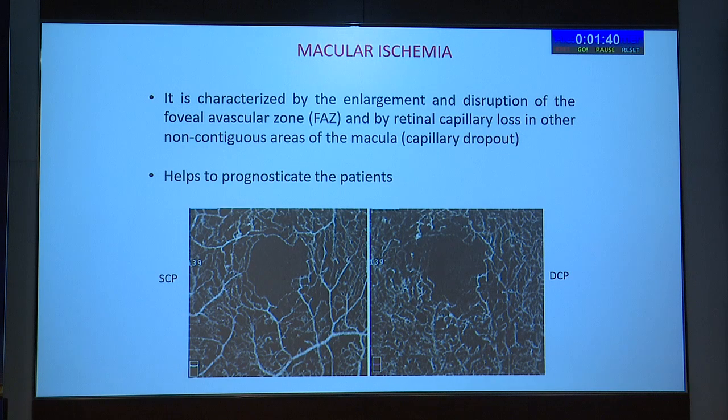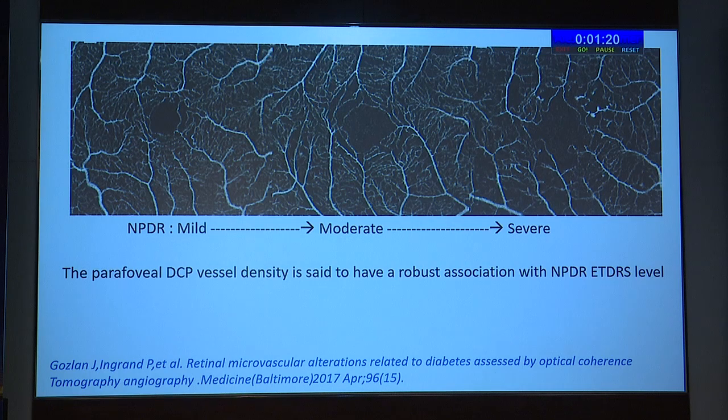Often these patients have nephropathy, and an FFA may be contraindicated, or you're not able to get a clearance, but you want to assess what the macular status is, how ischemic it is, and whether the patient will benefit from you performing a vitrectomy or not. This can be very well assessed on an OCTA, where you can avoid all the complications associated with an FFA.